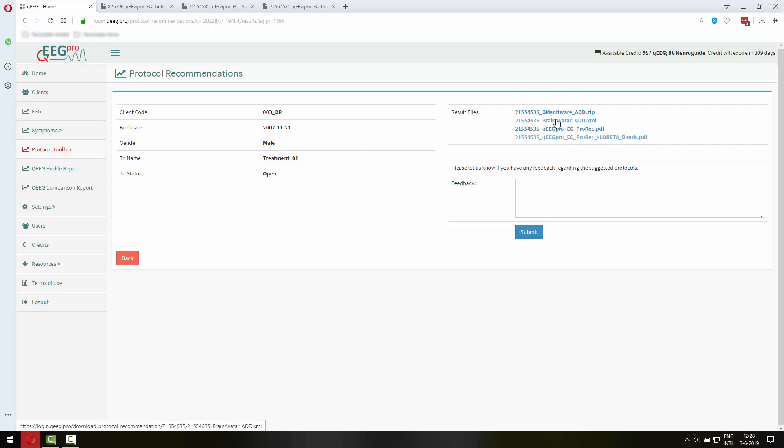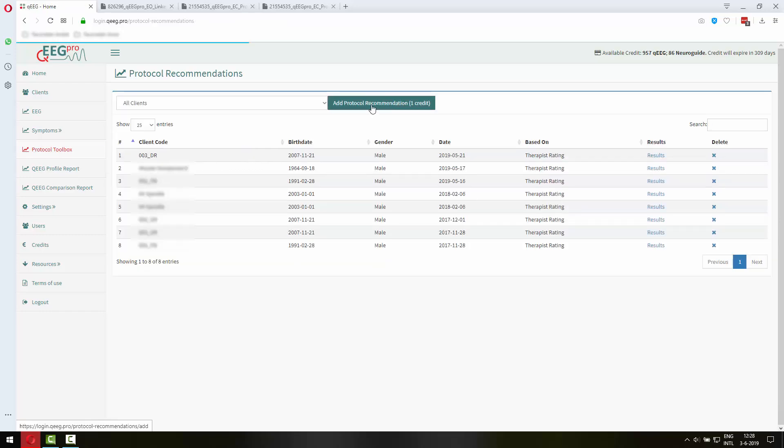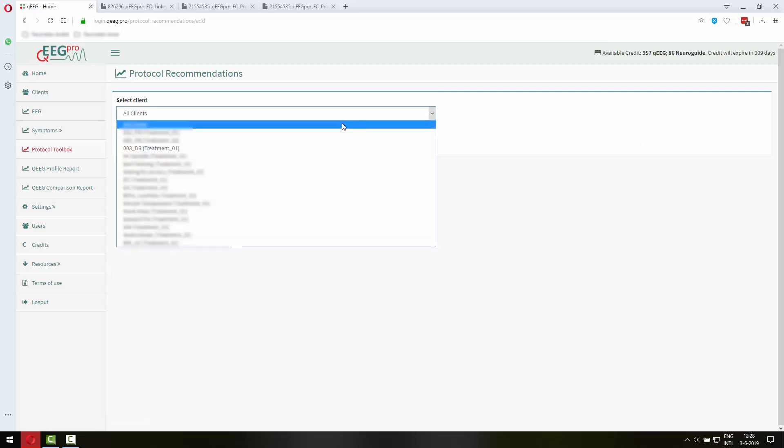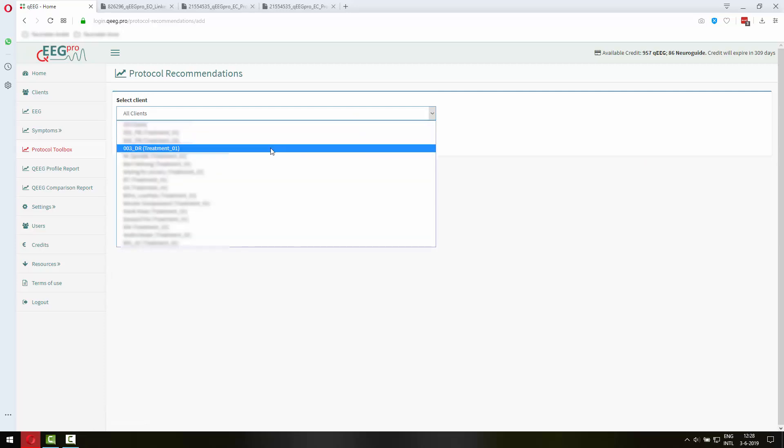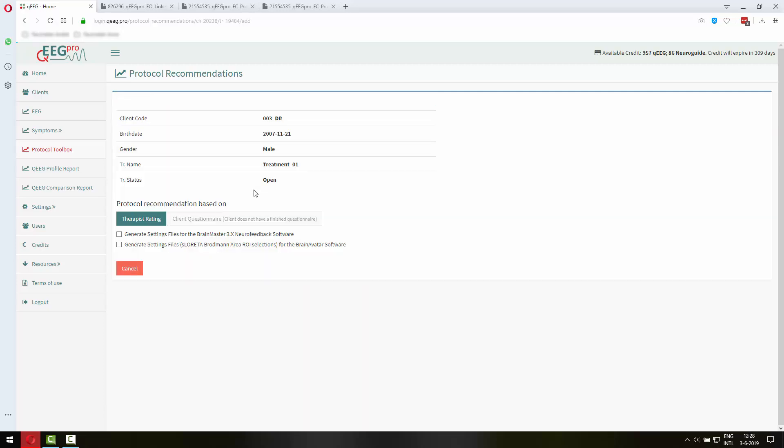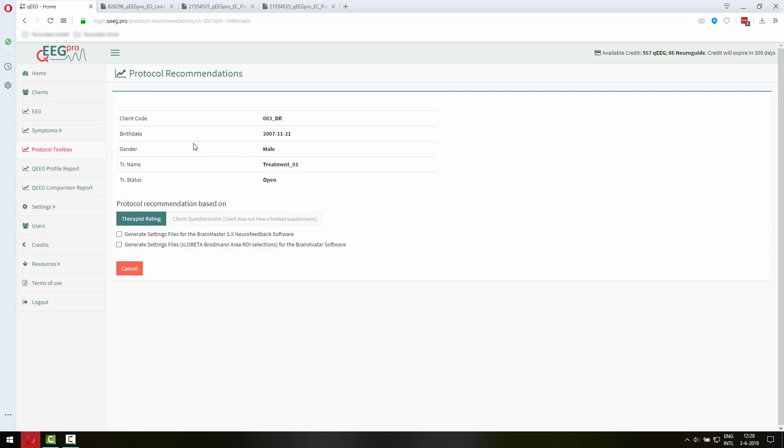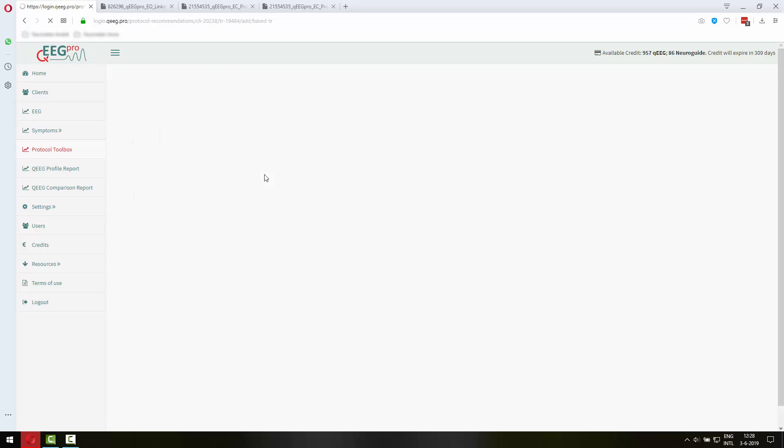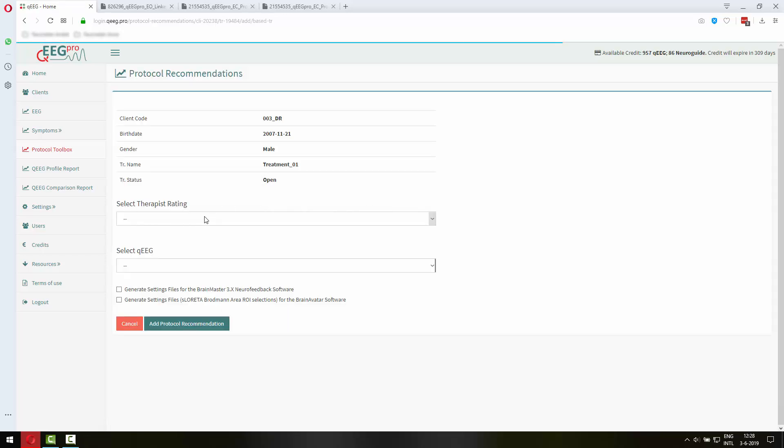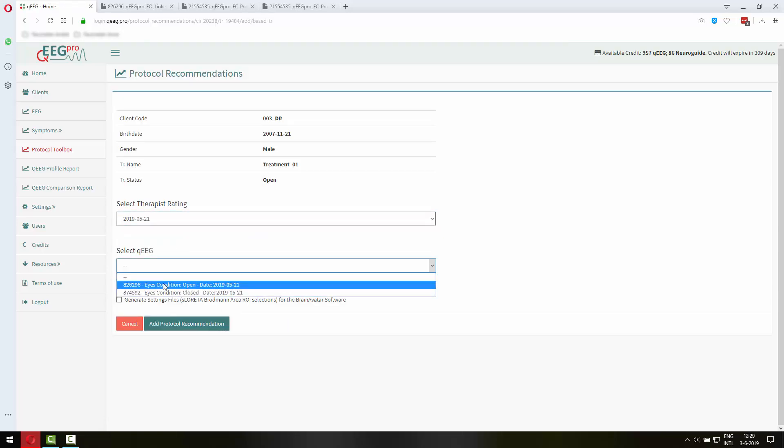This is the settings file that can be used in the Brain Avatar software for sLoretta Z-score training. And the way you can request that is quite easy so let me show you how to do that. So you go to QEEG Pro Protocol Toolbox, add a protocol recommendation, select your client and then base your protocol recommendation either on the therapist rating or on the client questionnaire. So let's select therapist rating and select the QEEG.